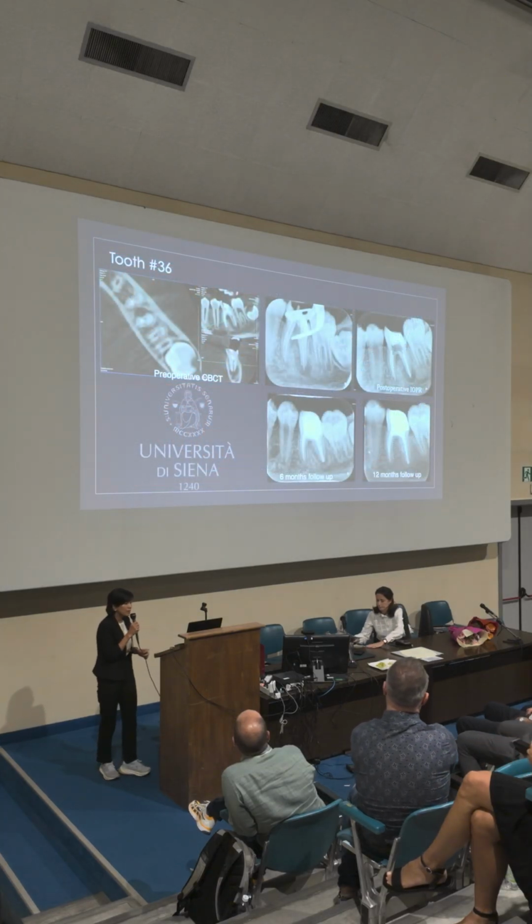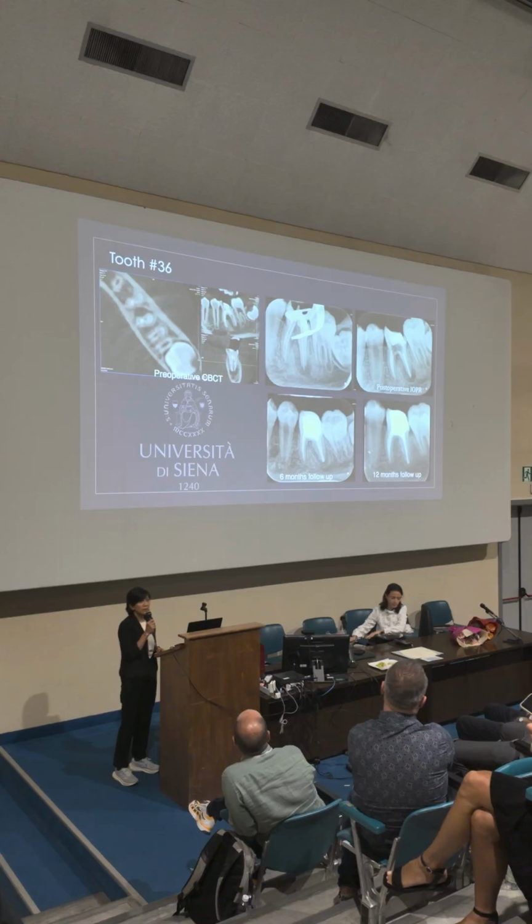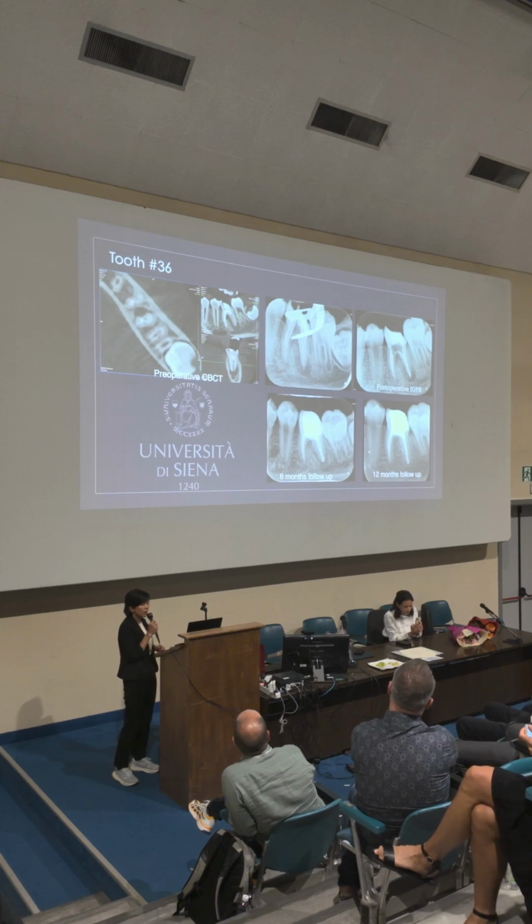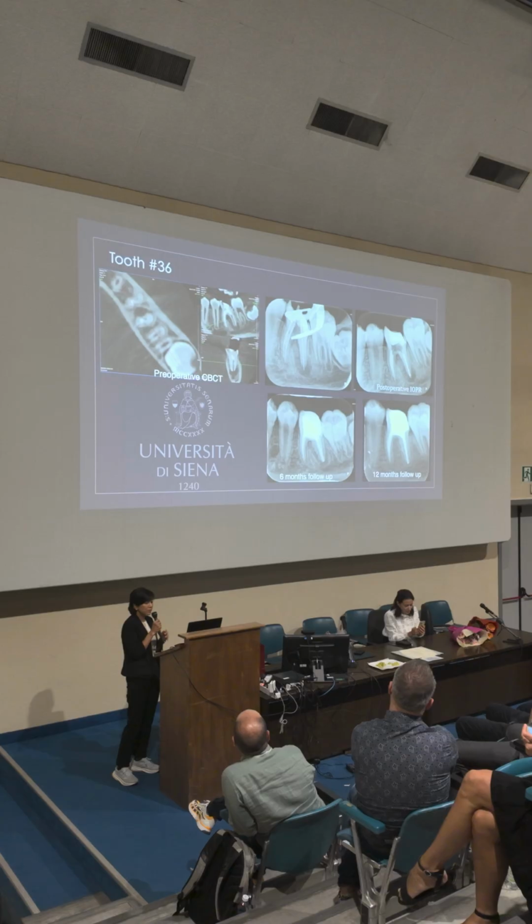And for tooth number 3-6, I did the root canal retreatment. And for the distal root, because of the open apex, I did the apical plug. And this is the result after 12 months.